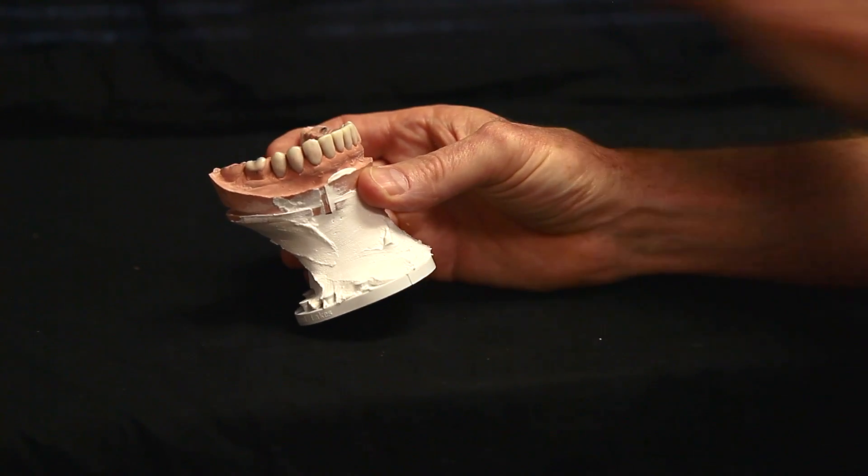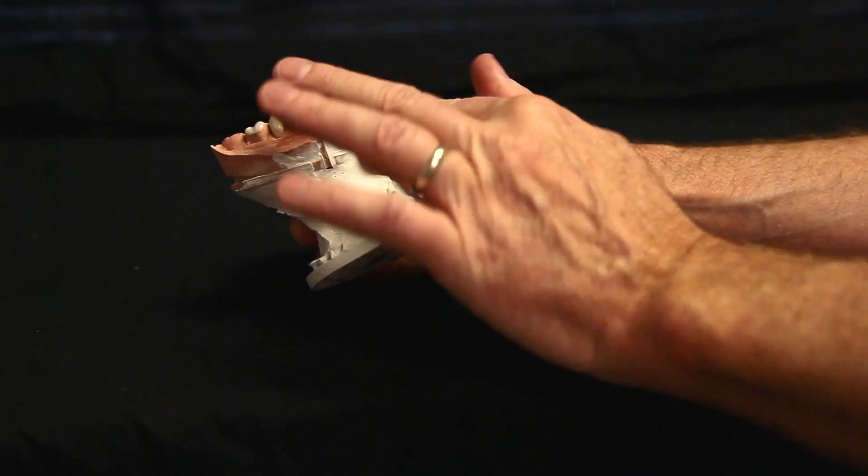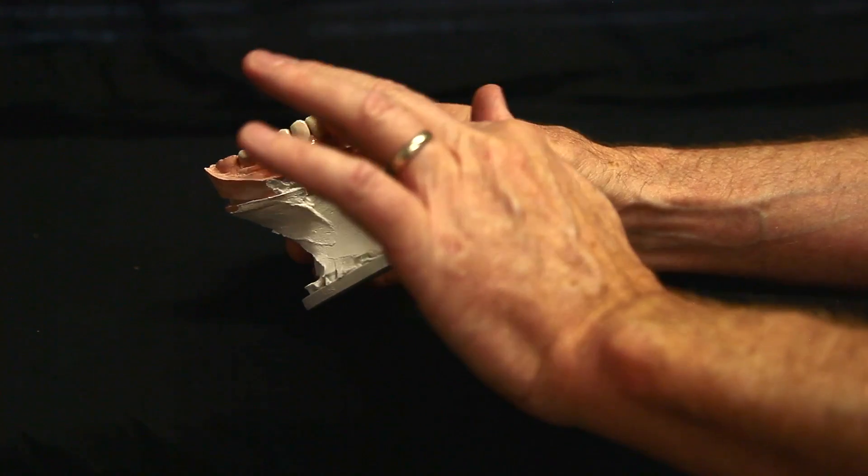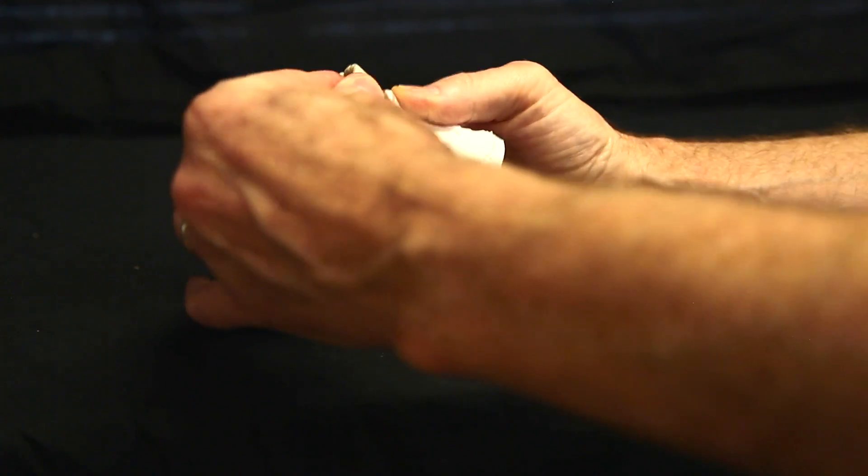First, you want to do is I've found if you just lubricate the wax very slightly, and this material is neystone dilube, it'll prevent plucking of the wax-up and the wax when you're taking your fabricated matrix off.